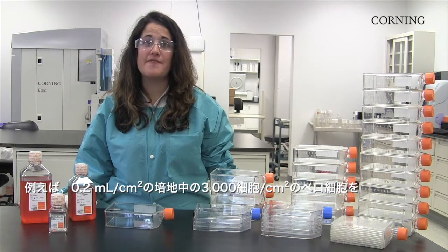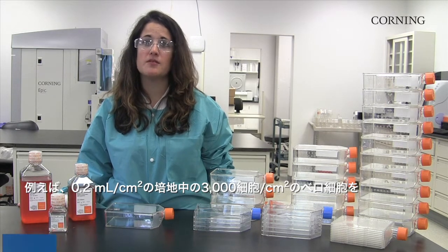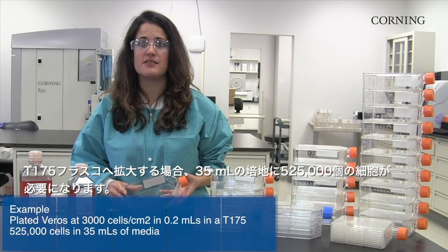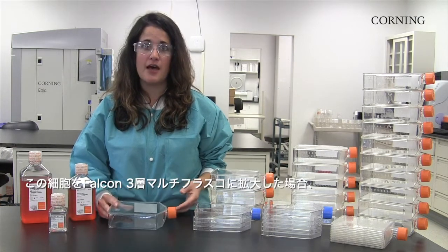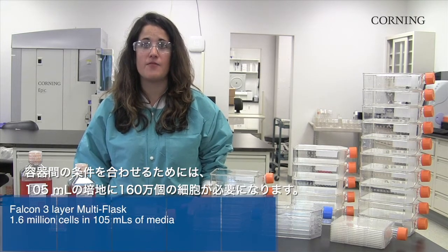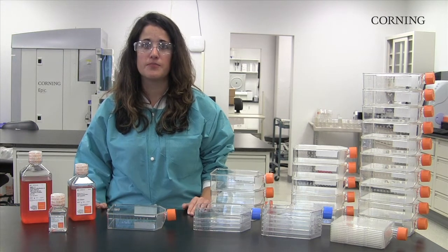For example, if I plated Vero cells at 3,000 cells per centimeter squared and 0.2 mL of medium per centimeter squared in a T175, I would need 525,000 cells and 35 mL of medium. If I then expanded the cells into a Falcon 3-layer multi-flask, I would need 1.6 million cells and 105 mL of medium to maintain consistency between the vessels.